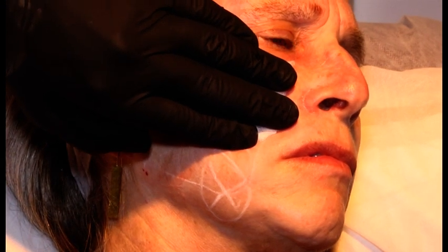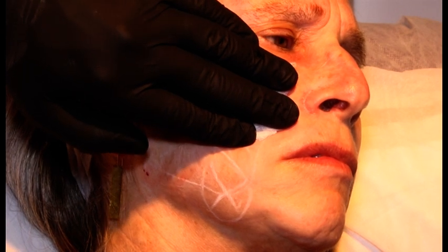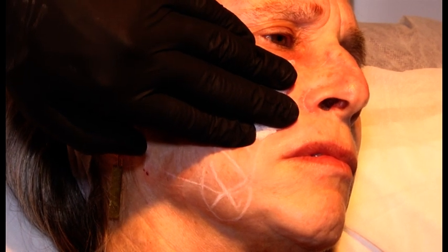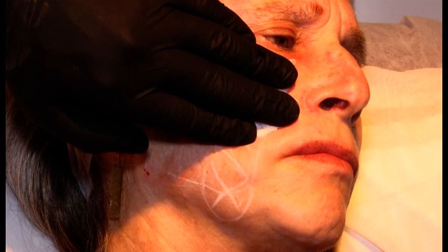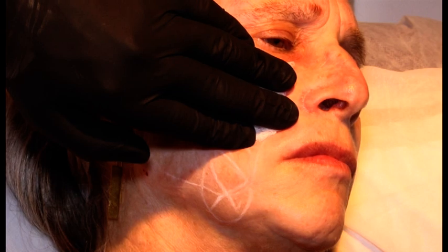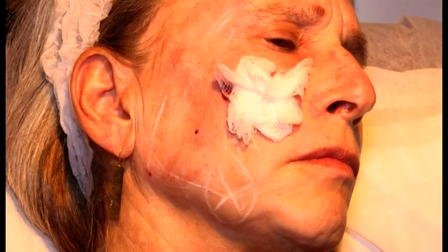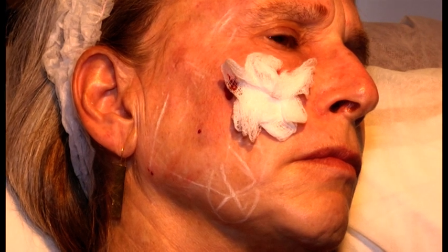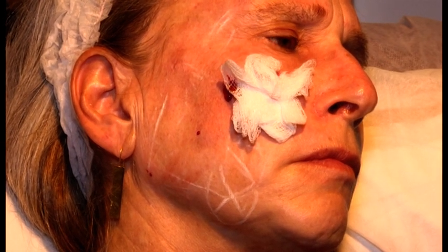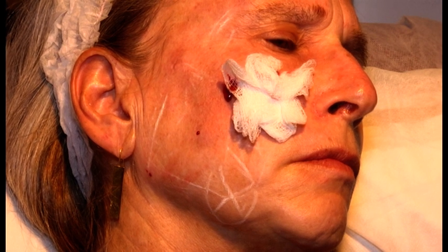Can you give me one syringe of Radiesse? Because I don't like to have air inside the system. Can you give me a new syringe of Radiesse? New? Open from the box? Yes, it's one dilution. No, a new non-diluted Radiesse. And 2 syringes, 1 syringe with 0.5 cc's of lidocaine and 1 syringe with 1 cc of saline. And a luer lock connector.